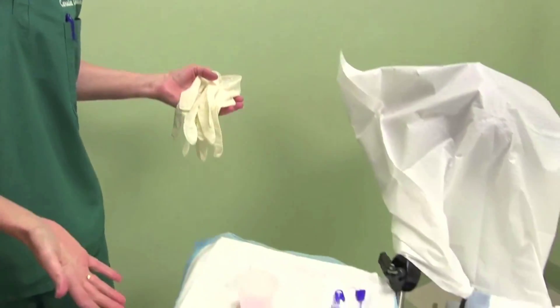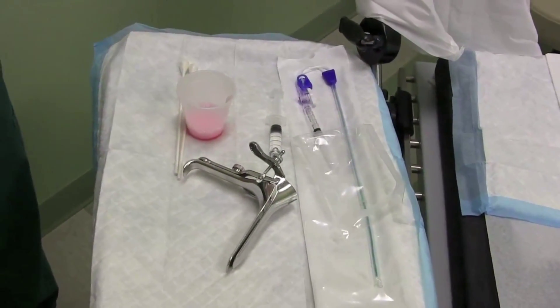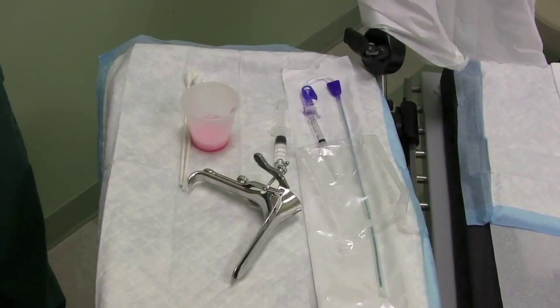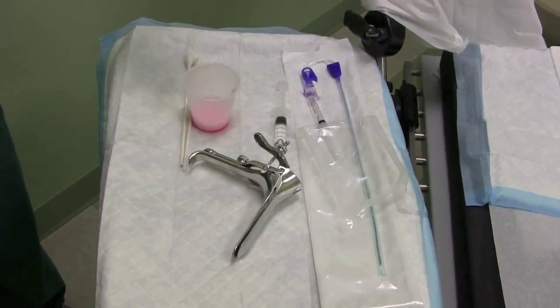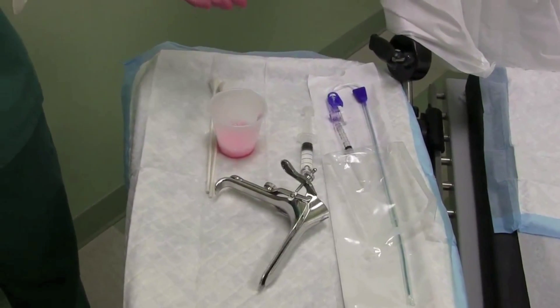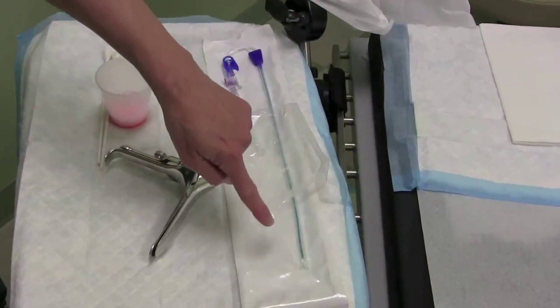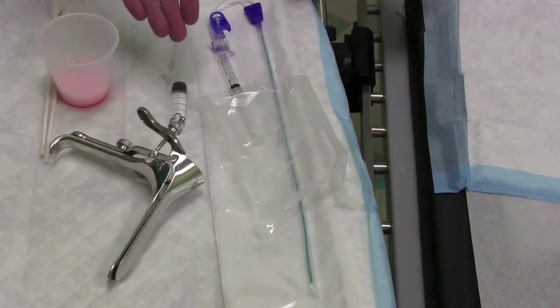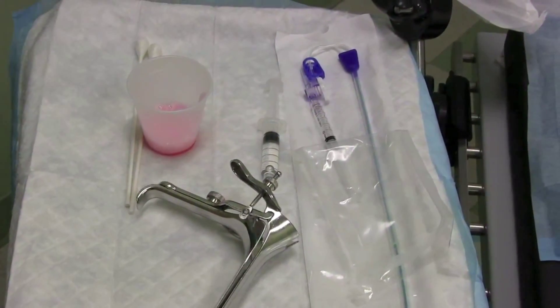This is the typical tray that we use to set up for our HSGs. I usually tell patients that I consider this a super-duper pap smear because it really involves a lot of the elements that all women are familiar with from having their annual pap. Basically the test will involve just inserting a small speculum, we'll wash off the cervix and vagina with some cotton balls and a little bit of soap, and then this skinny little spaghetti noodle catheter goes into the uterine cavity and we're just going to put the liquid radiographic dye in and hopefully we'll see the cavity be normal and the tubes spill out the dye.